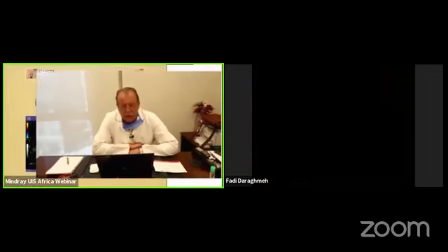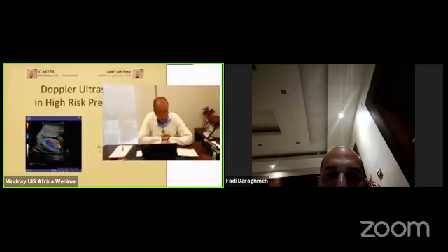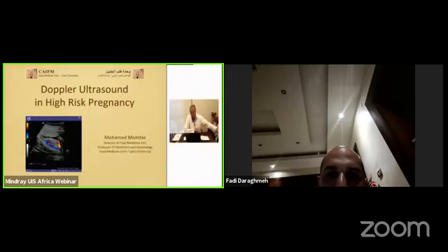We will talk today about Doppler ultrasound in high-risk pregnancy, and this will be a presentation for about 30 minutes. Then we will take a break for about 5 minutes, and then we will do a hands-on demo. This hands-on demo will be on a live case showing exactly how to take the Doppler measurements that we're going to explain to you during the presentation.